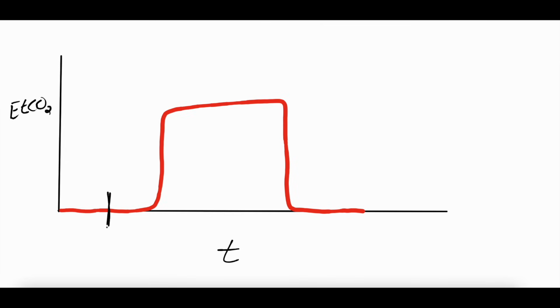Here we know that this is inhalation, right? It's inhalation where we're inspiring into our lungs, so the sensor is seeing no end tidal because the air is flowing into the lungs. The air the sensor is seeing is just from the ventilator, from the atmosphere, until you get to phase 1. And phase 1 is when we start to expire. But at first in phase 1, the end tidal is still 0 because this is all dead space.